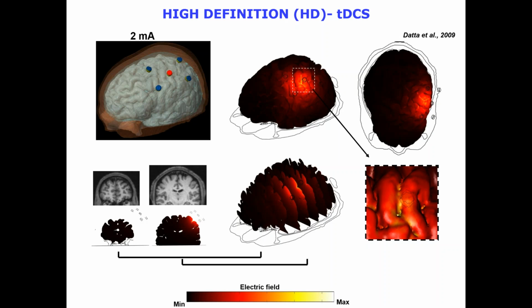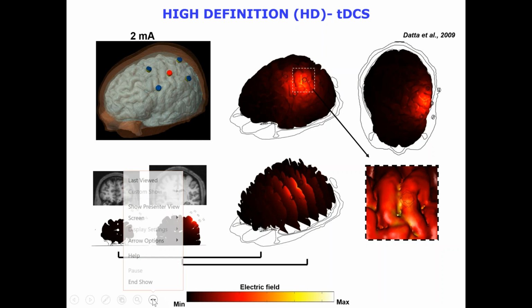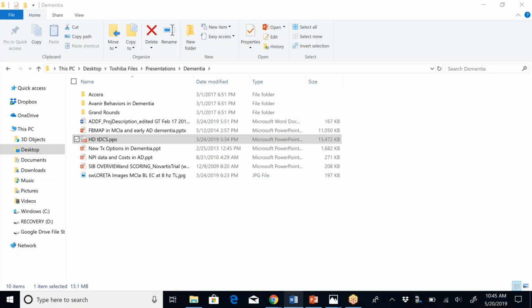So it's a lot of those kinds of approaches to ultimately find what is the best treatment protocol for the patient, which one they responded most to, so that they can then stay on that for a maintenance period. So if they need to be treated once every couple months, once a month, we know what the best treatment is. So there's a lot of experimentation like that.